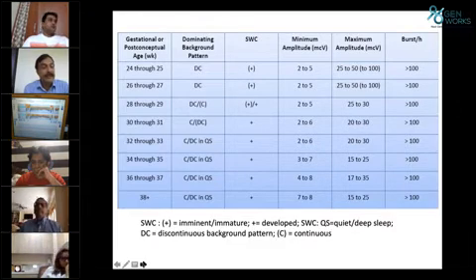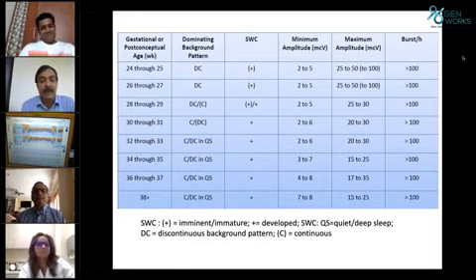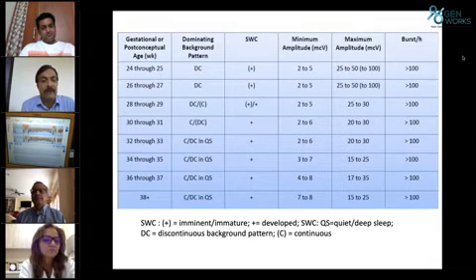A second thing she mentioned, describe the cyclicity or sleep-wake pattern. And that is there in this picture. And then maybe we have the minimum amplitude and maximum amplitude, which may not be of much importance. Let us concentrate only on the first two columns.